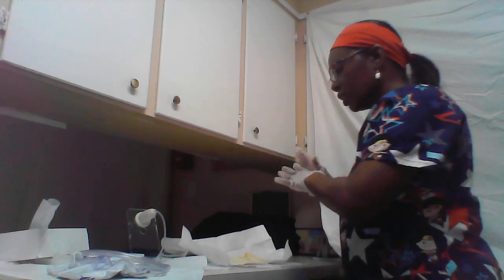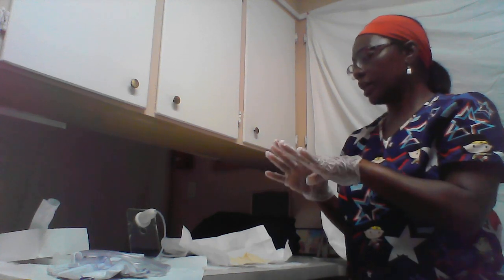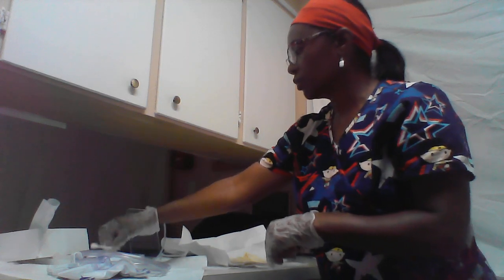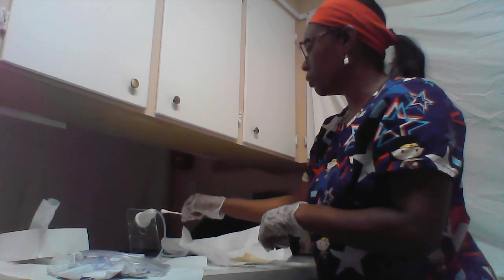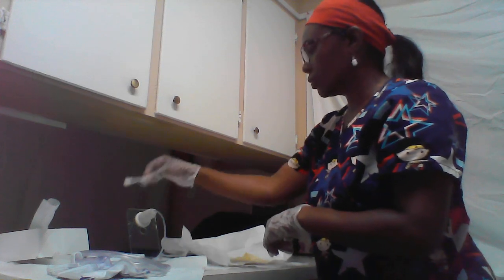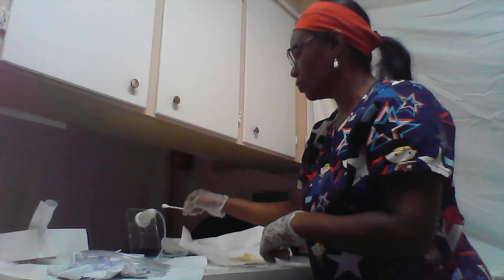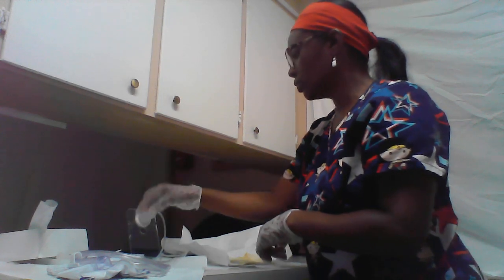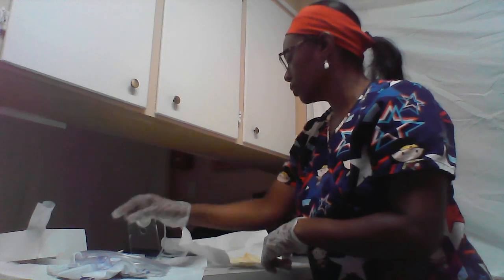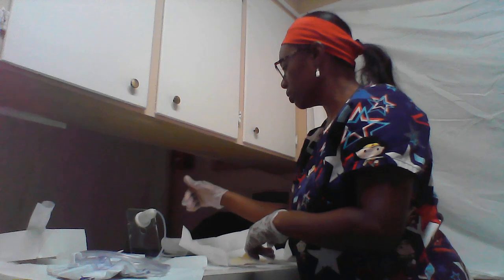And I'm going to remove my gloves, wash my hands, apply gloves, and I'm going to do catheter care around the meatus of the penis in circular motion on each side. Another side. And then I'm going to come back and dry the area with a dry gauze.